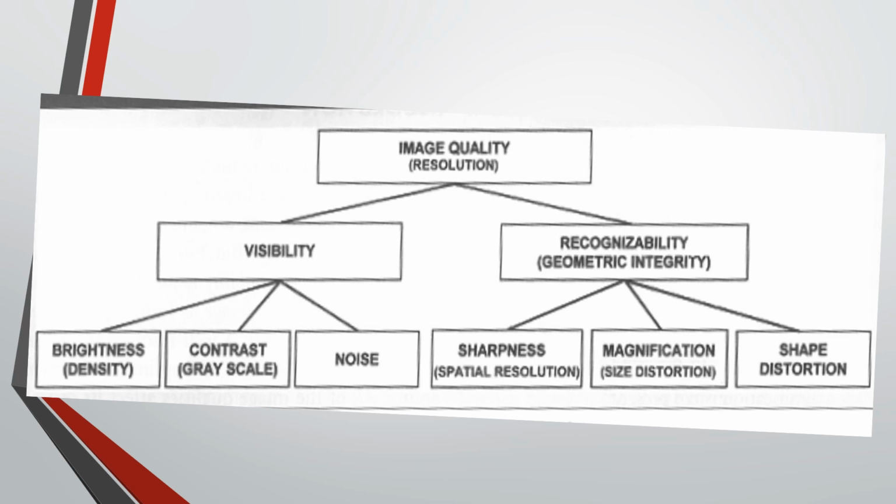The primary factors, again, to remind, are kVp, mAs, and distance. These are the primary things that we can control of the radiographic image. The secondary factors are things that we have less control over, but collectively can change what we do greatly, depending on what's present and what technique we're setting when we're exposing, when we're taking an image.